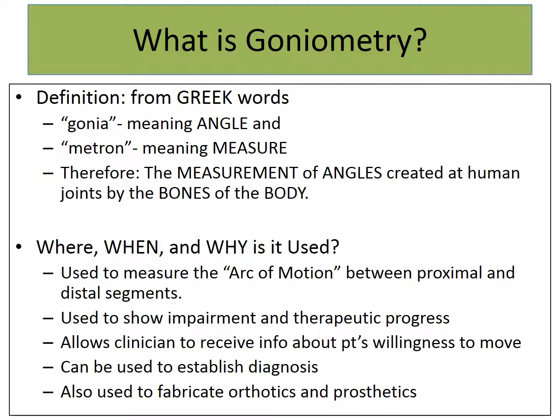As I said, with the PT doing these during evals, it'll help to come up with a diagnosis, trying to determine between tendon and ligament. Also, range of motion is used when an orthotist is fabricating orthotics or when they're making a prosthetic for a patient as well.